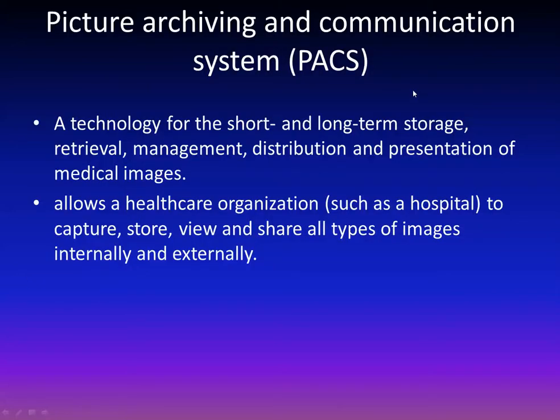So what is a PACS? A PACS is a picture archiving and communication system, and it's important to realize it is a system, so it's not just one particular thing. It's a technology that allows for exchange of information between short and long-term storage, retrieval, management, distribution, and presentation of medical images. So it's allowing that healthcare organization to transport their HIT, so their health information technology, over the internet, and ultimately store it or get it to the radiologist to be viewed, things like that.